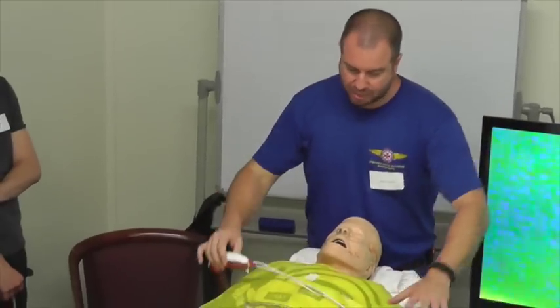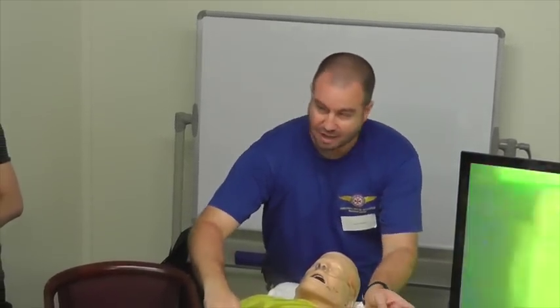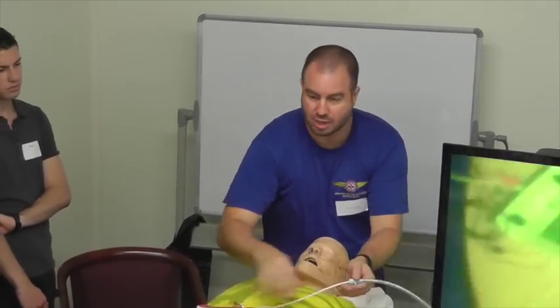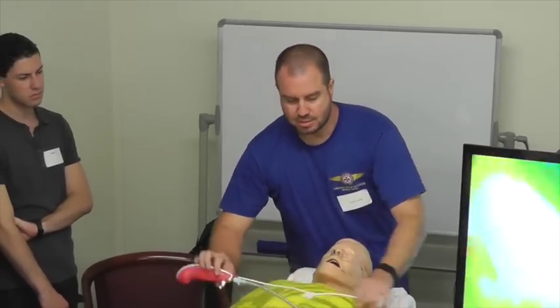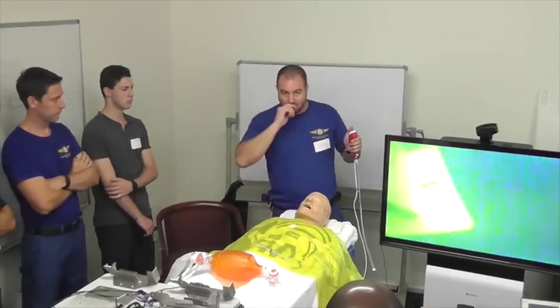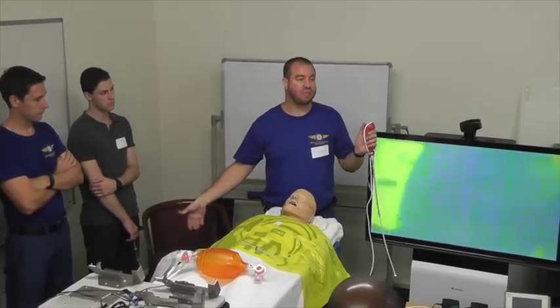What I'm going to do is position my patient and have my airway assistant briefed. I'm going to preload my size 6 reinforced tube, which is in the kit, and we want you to use that every single time. If you're short, I would stand on a box and put the bed on the floor, and then I'll do the procedure with a briefed airway assistant.